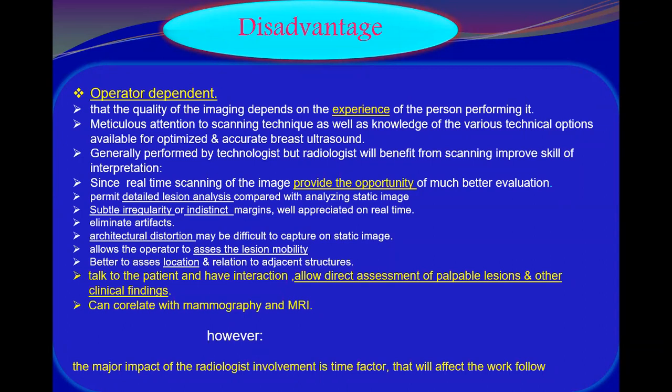Generally, breast ultrasound can be performed by technologists or radiologists. However, it should be interpreted by the radiologist. But it is preferable for the radiologist to perform breast ultrasound. Why? Because real-time scanning is not like the static image. It provides a lot of opportunity that improves interpretation skills.